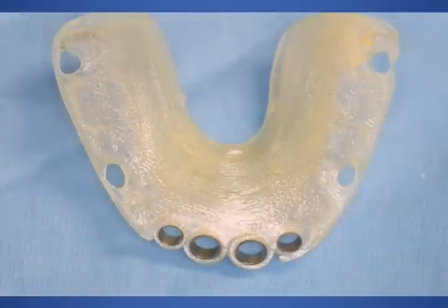Here's an occlusal view of the same. We have a tight situation, 2 laterals and 2 central incisors, but we were able to use the computer to properly angle and position our dental implants, so we knew that we could use a surgical guide in this situation to ideally place the implants. If we were unable to use this, or if we were unable to place the rings or to stabilize them correctly, we would probably do this case freehand.